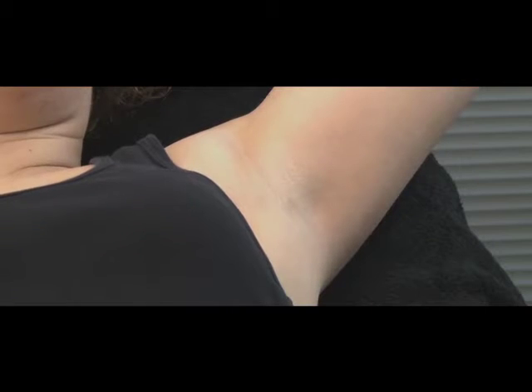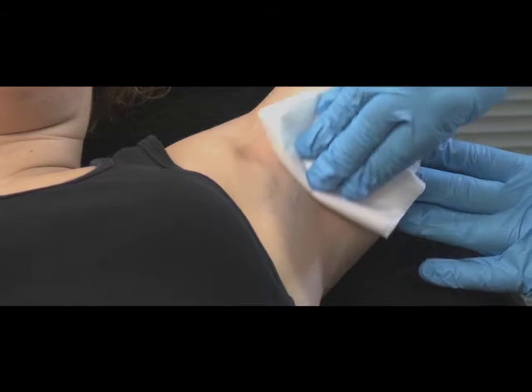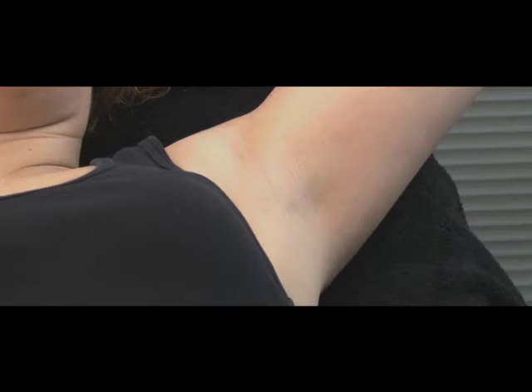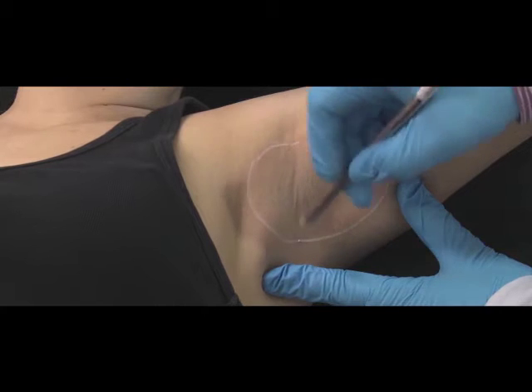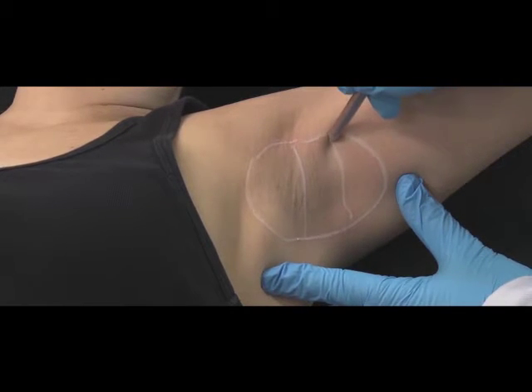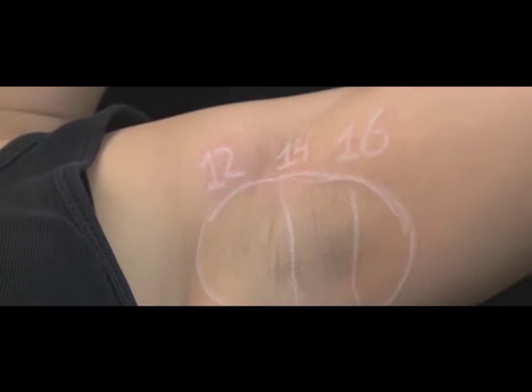Before any laser treatment, always make sure the skin is completely clean and there is no sign of any makeup, cream, or deodorant. Residues can lead to burns. The test spot can be used to check the reaction of the skin and also to determine the optimal parameters for treatment. One way to achieve this is to mark off an area and divide it into 3 parts.